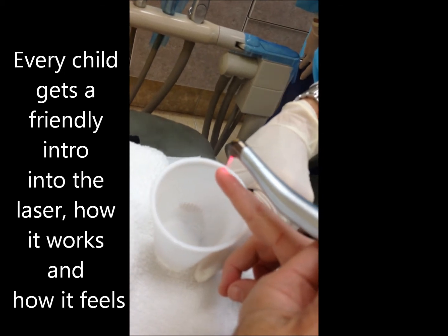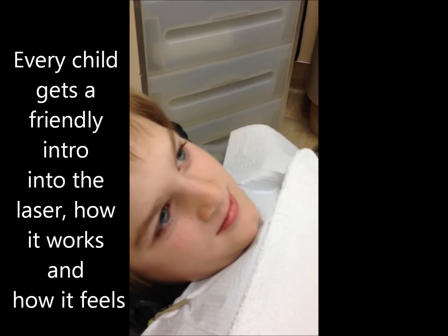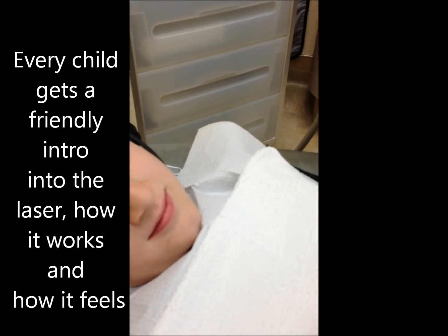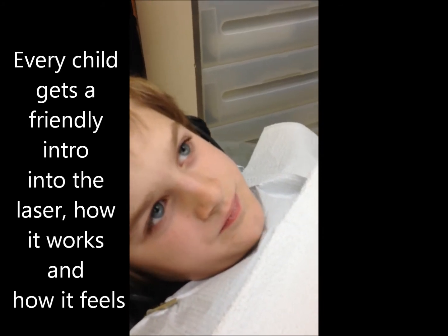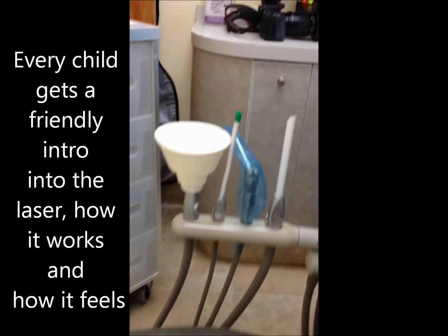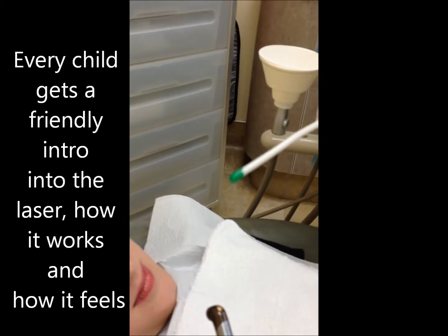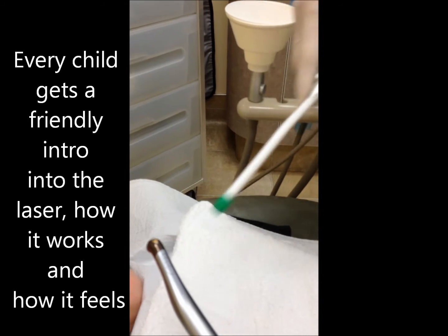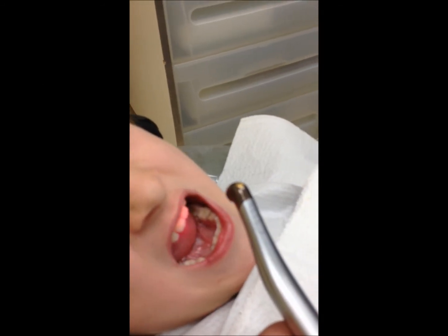That's where I'm going to hold it, right over the tooth, all right? Is that cool? And we're going to count to five, and then give you a break every time, all right? Then you're going to close your lips around that straw, so that it sucks away all the water. Is that the vacuum? Yeah. So, let's practice. It's just water first, okay? All right? Okay, open.